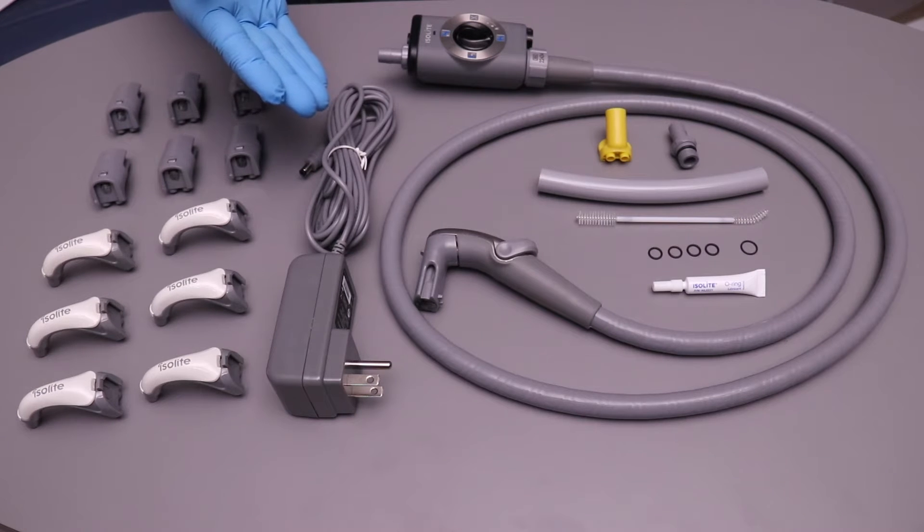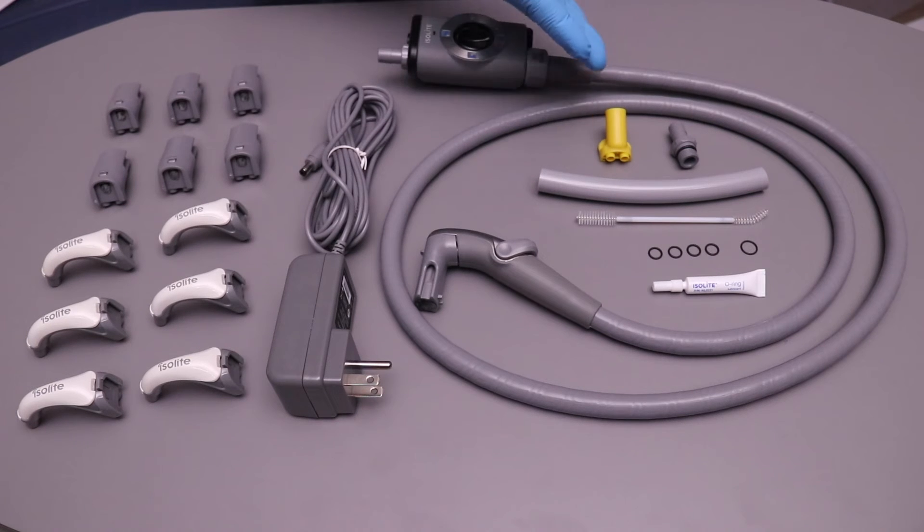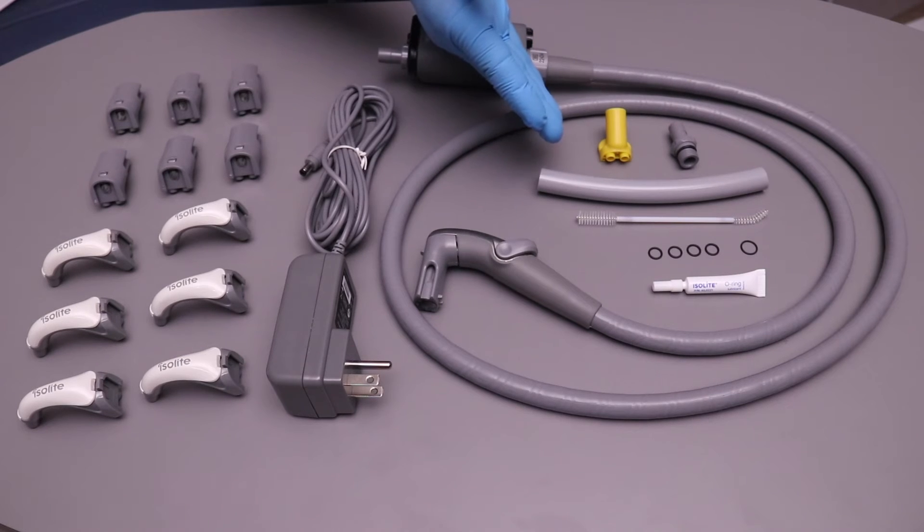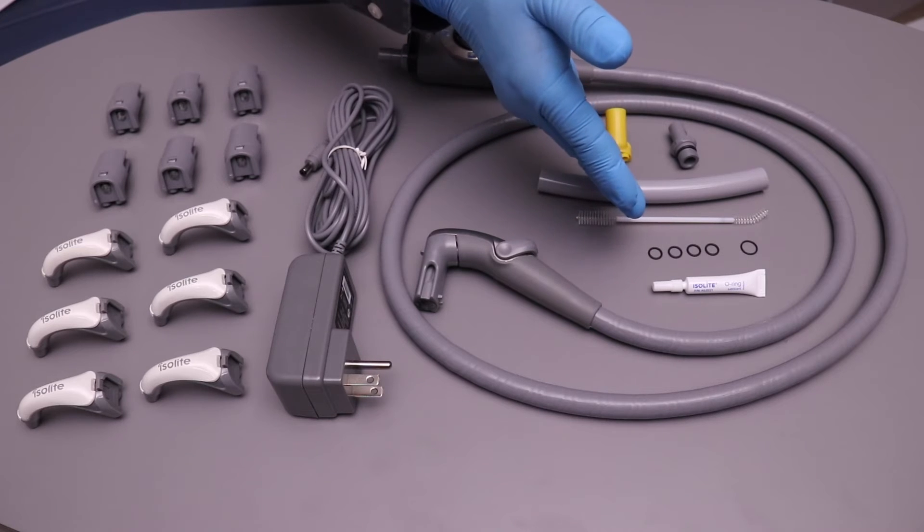There's a power supply, and it also comes with a cleaning tip, a barb fitting for an additional hose if you want, 6-inch HVE tubing, double-ended cleaning brush, and O-ring kit.